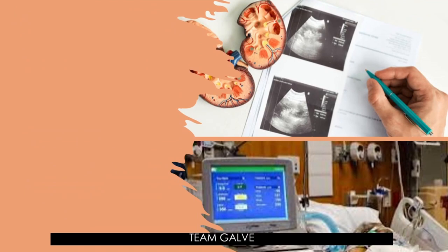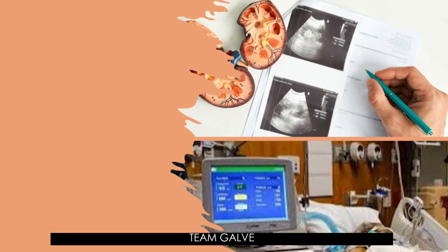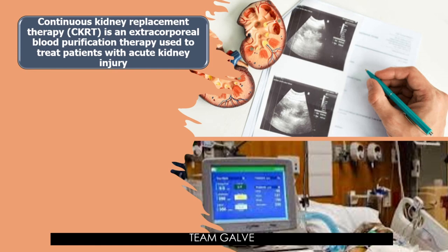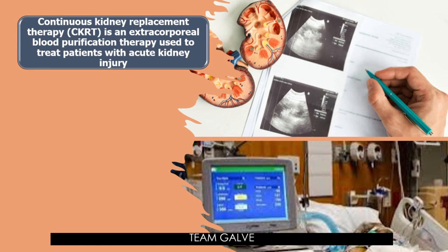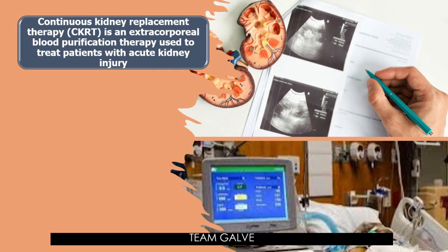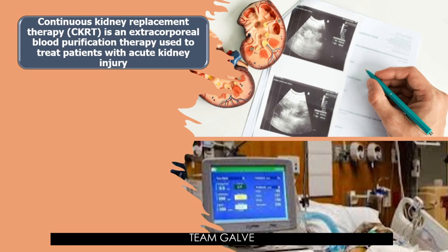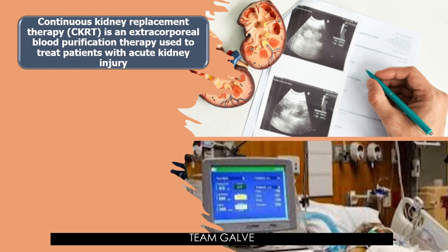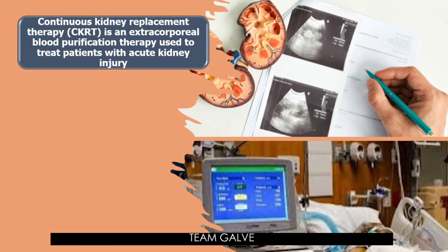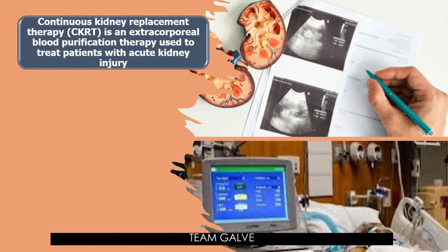Continuous kidney replacement therapy, or CKRT, is an extracorporeal blood purification therapy used to treat patients with acute kidney injury — AKI. Unlike the more traditional hemodialysis, CKRT administration occurs around the clock, providing patients with continuous therapy. The doctor typically orders CRRT or CKRT to run for 72 hours — continuous.